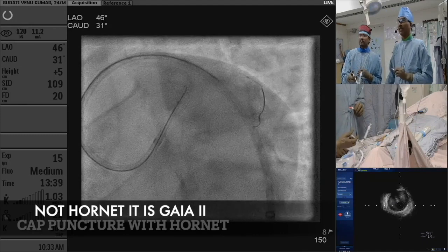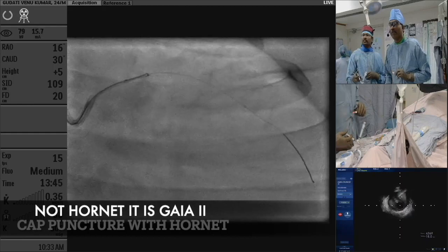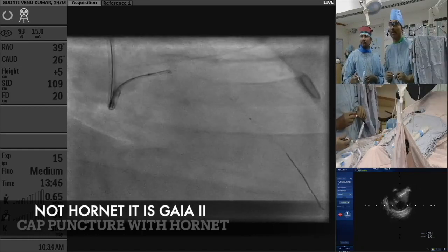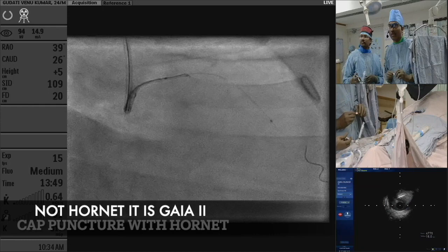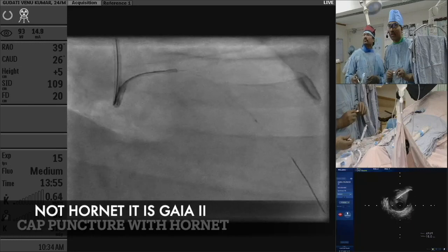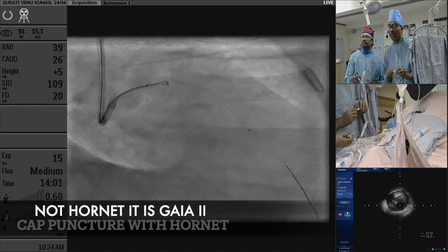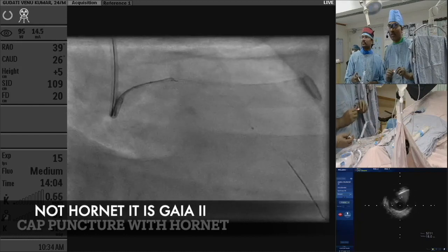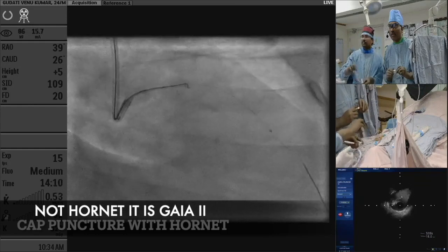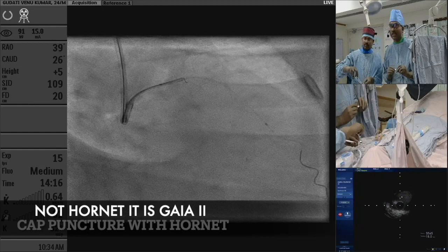Okay, just come to epicardial, please. So our entry is perfect.